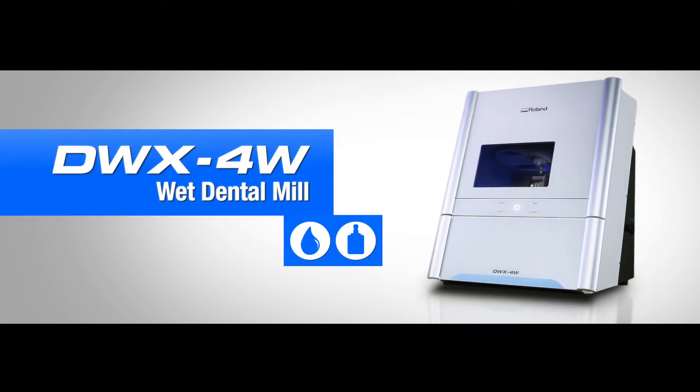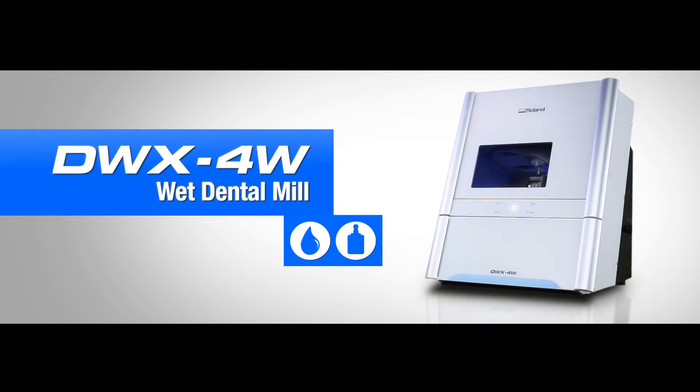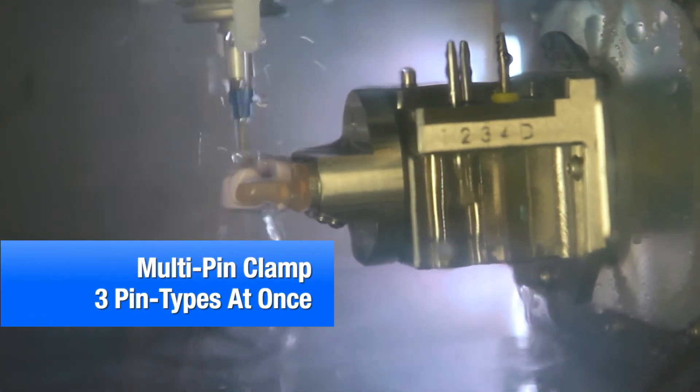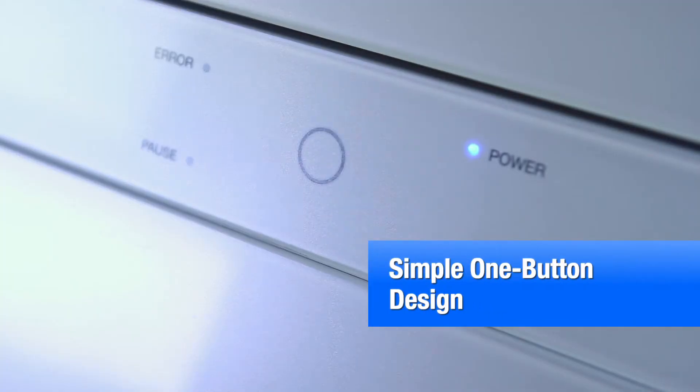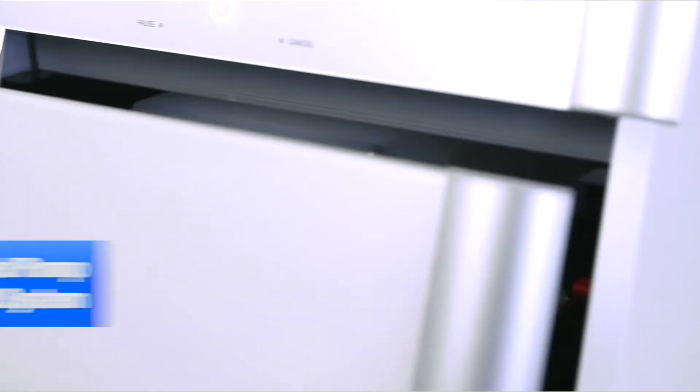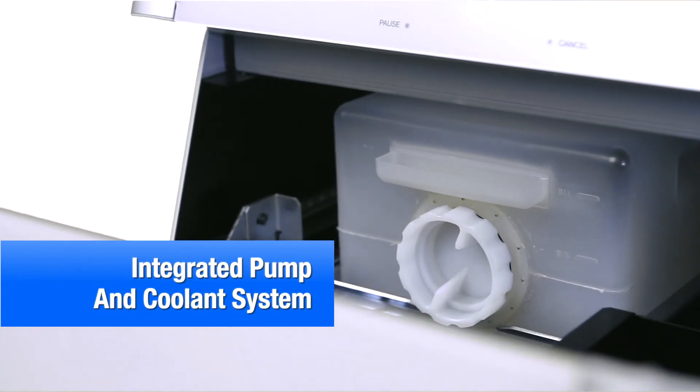Meanwhile, the DWX4W wet mills glass, ceramics, and composite resin dental restorations, combining precision performance with user-friendly operation. Quick, easy, and efficient setup and use ensure that your business never has to stop or slow down.